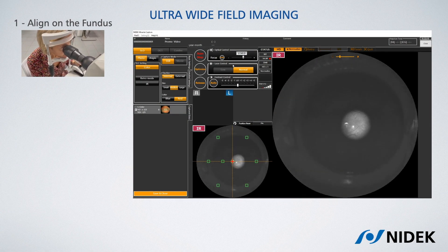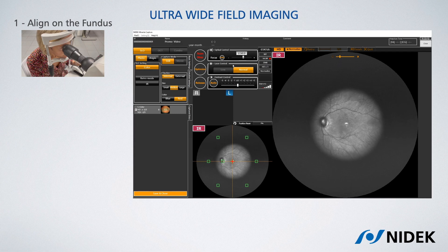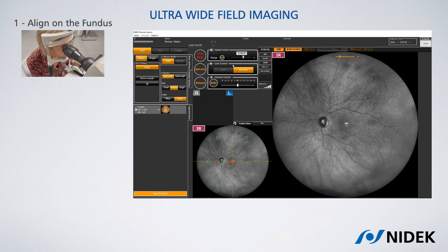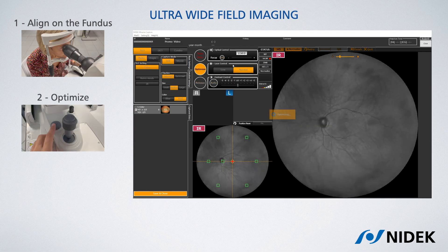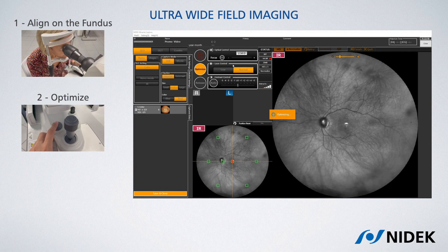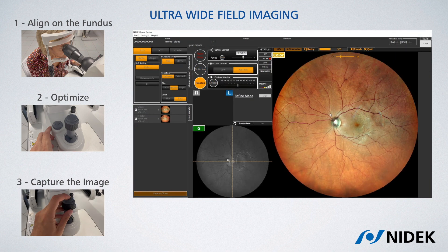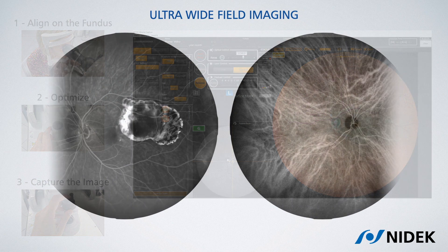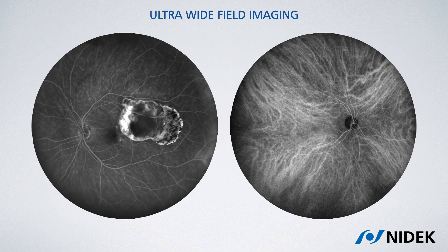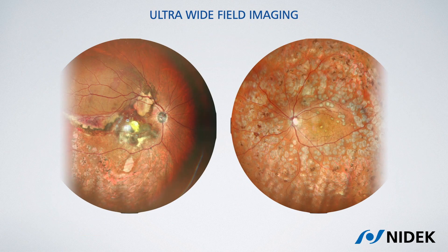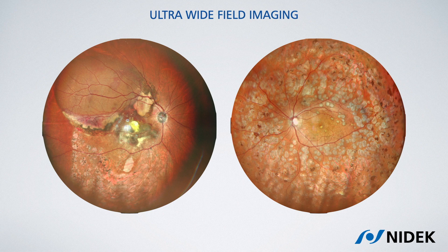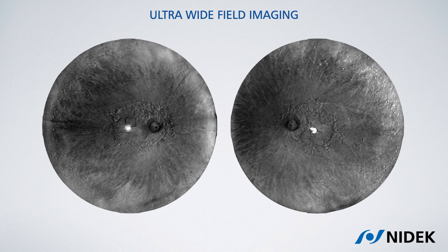As the attachable ultra-wide field lens is more protrudent, one trick to avoid touching the patient is to swing temporarily and tilt inferiorly the optical head. We can then proceed with the optimization of the fundus pictures and capture. In this very same way we can also take ultra-wide field fluorescein and indocyanine angiographies, ultra-wide field color images, and ultra-wide field retro mode images.